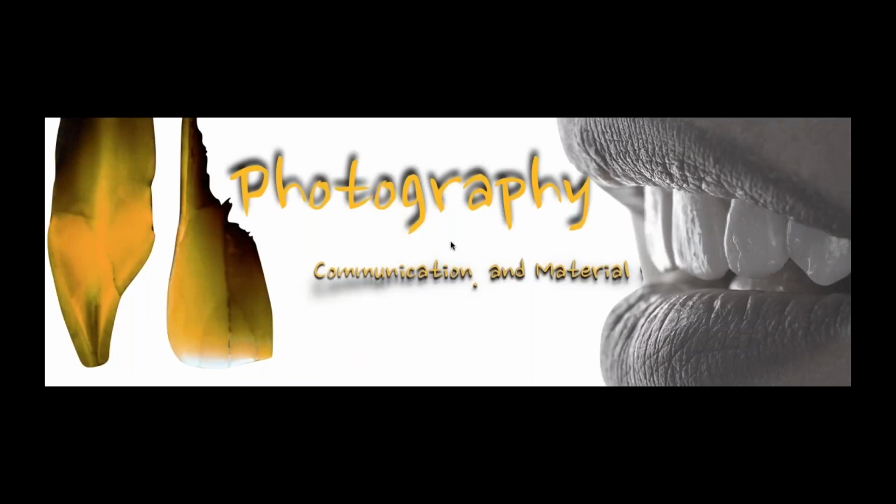So that's where one part of the photography becomes really critical for me, is actually using it to see the face and the transfer system and make sure that we're working through the process to the best of our ability. The actual camera part itself is a little less complicated, but also just as important.